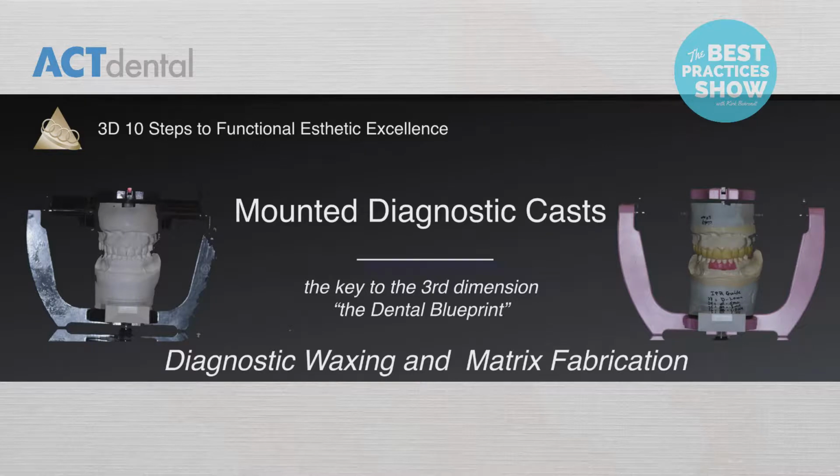So the essential step for this additional records is that we get CR mounted, FaceBow mounted models on our articulator and good models. Quality in, quality out: good impressions, good laboratory work. And then from that, we get to do kind of a trial run on the models. What do we need to do to fix the functional issues? What do we need to do to fix the aesthetic issues? And that's where the plan basically gets developed. Now, eventually, we're going to be doing all this stuff digitally, but the foundation and the principles and the steps are all going to be the same. Right.